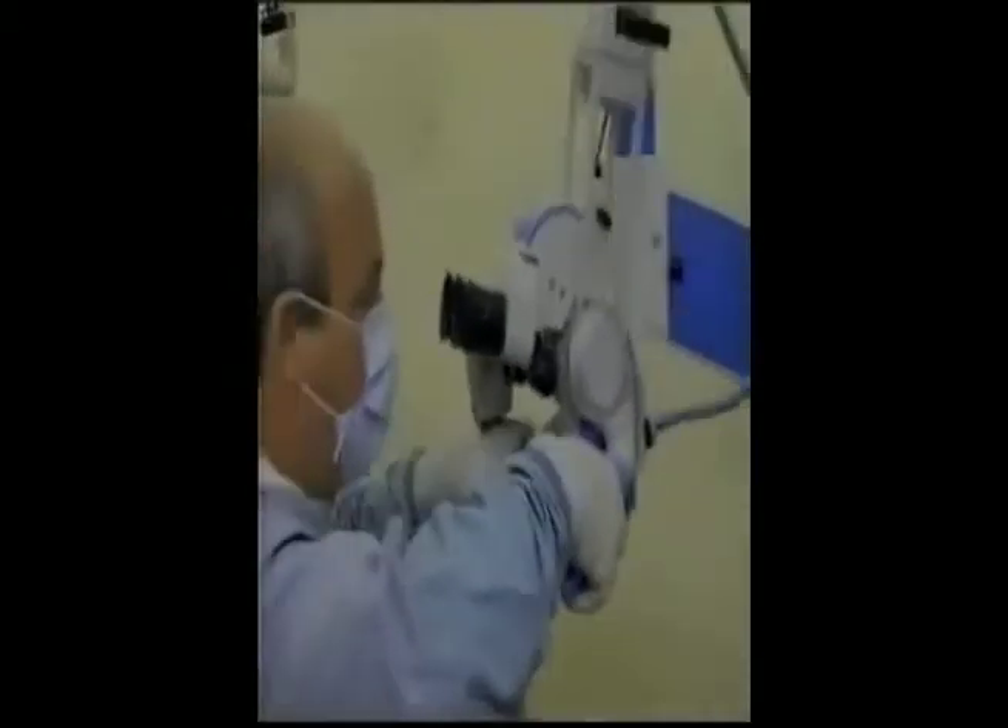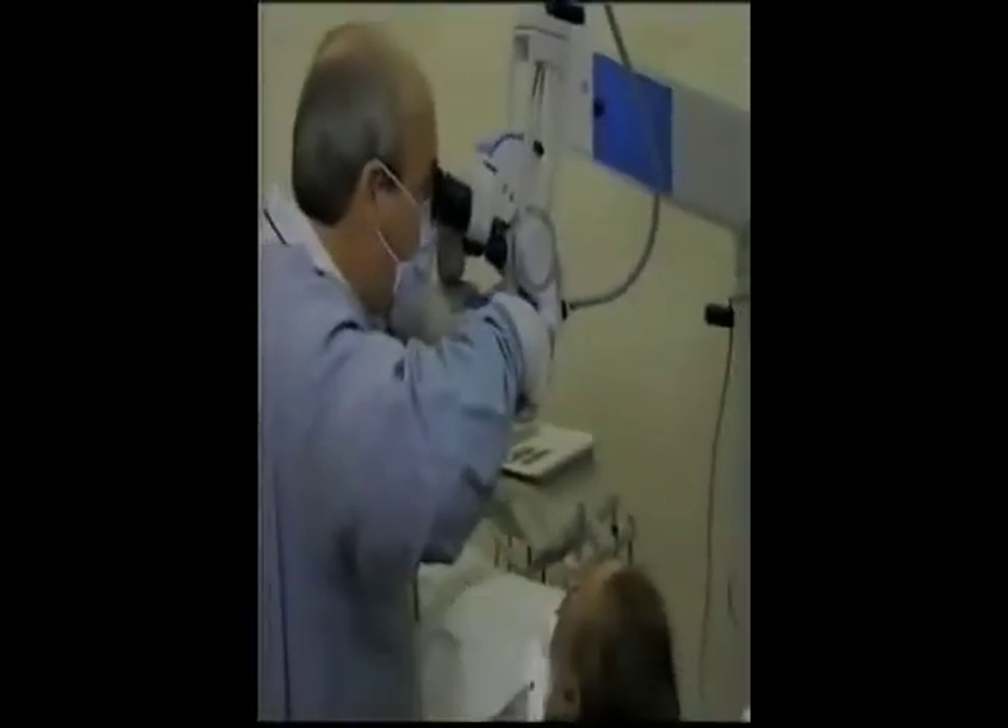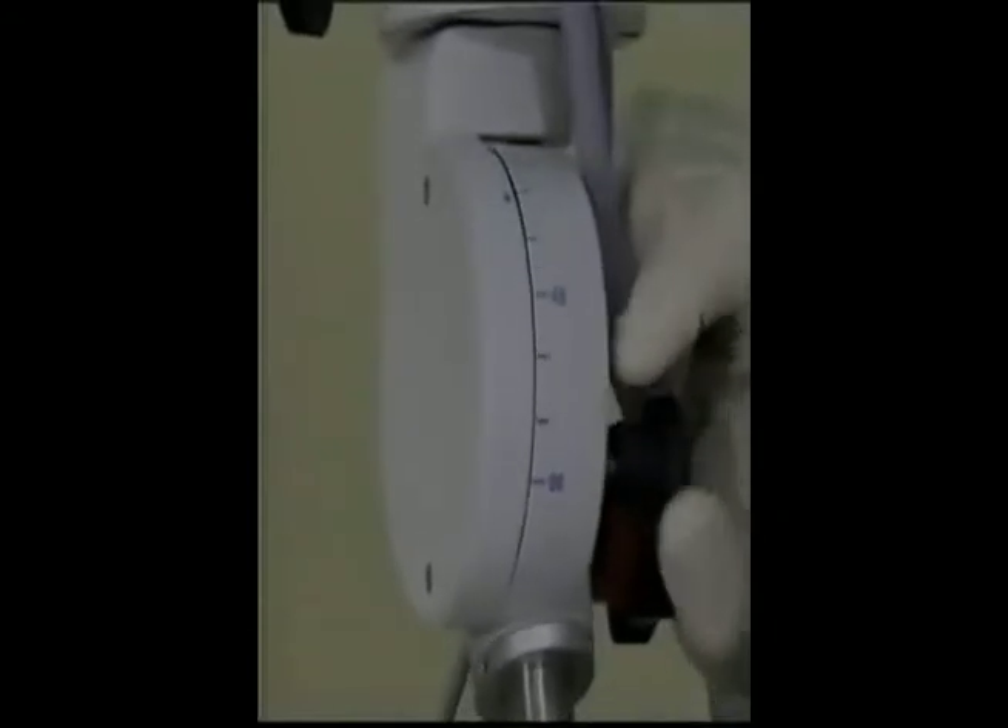Free-floating cardanic suspension means that the microscope can be positioned for ease of use in any direction. All movements are quick and effortless with smooth, instant locking in all axes.